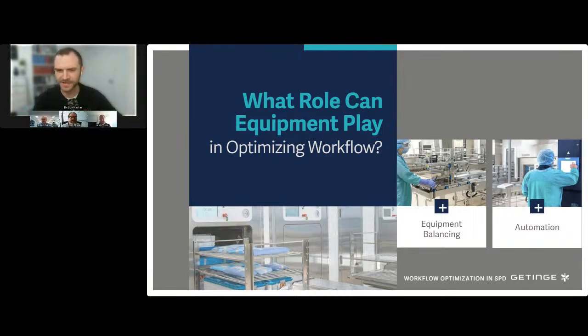And I'm not trying to take over this question, and this has nothing to do with equipment, so I apologize. But the batching at the prep and pack station and moving that onto sterilization, people build this castle of rigid containers around them where you can't even see them over it. Yeah. Get me started on that. And then don't take it to the sterilizer. So go ahead and get started, Andy. Like, what is the problem with that, and what thinking needs to shift in order to have a more efficient workflow?